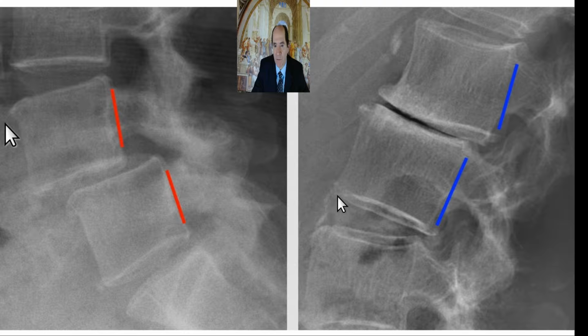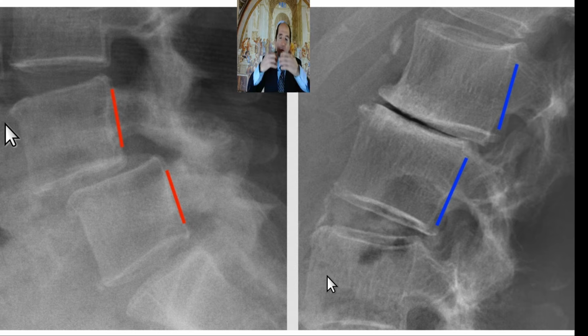And you've got some calcification. That's a type of osteophyte where it's more vertical. We call that a syndesmophyte, but it's equivalent to an osteophyte. So these are signs of progressively worsening degenerative disc disease. So this would be much worse than this because this is severe disc space narrowing. This is only sort of mild to moderate.